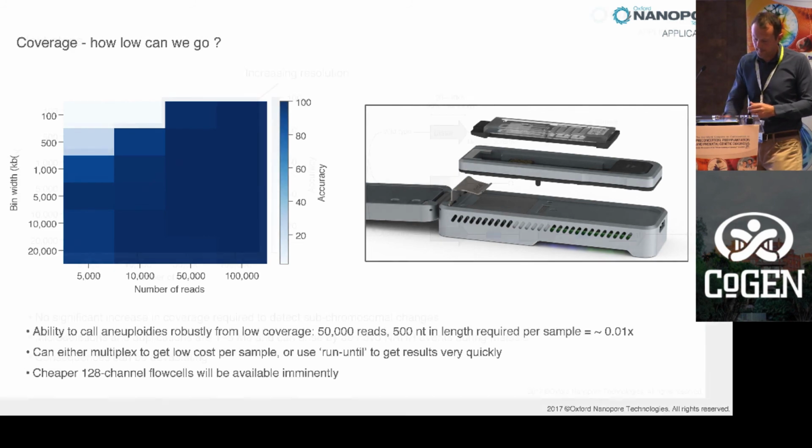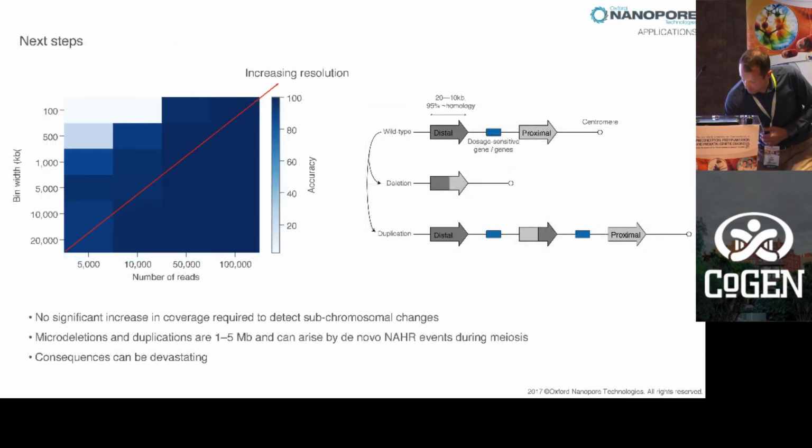Okay, so what next? I think this is overlapping a little bit with something that we heard touched upon before. What my team is here to do is to try and find as many different interesting use cases for the technology as we possibly can. One thing that we feel that we can do using this very analysis is to look at higher resolution than whole chromosome duplication or deletion effectively.